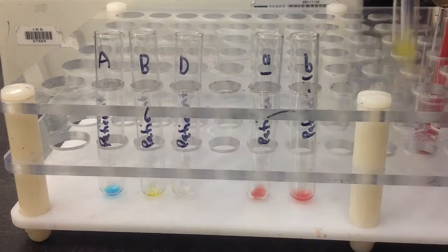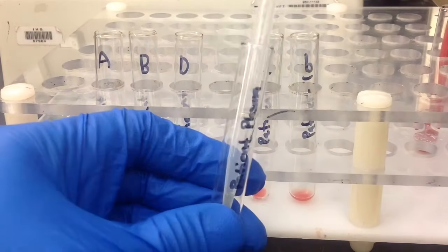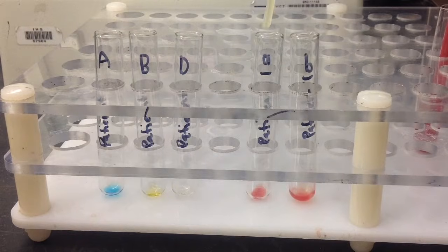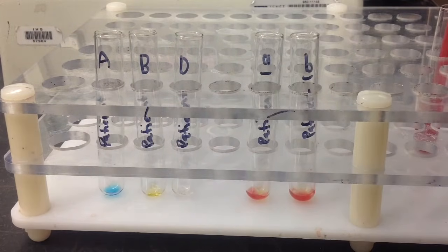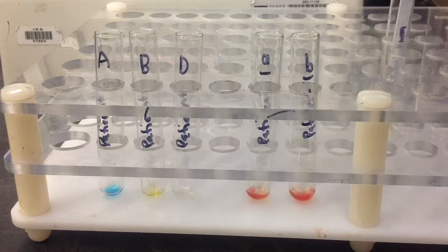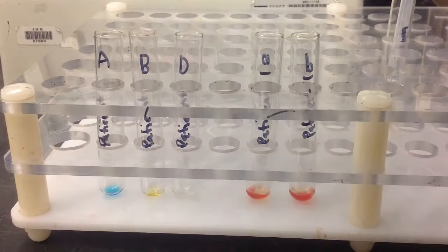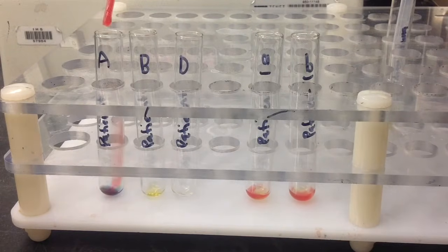And then from here, I go ahead and start with the plasma. And for plasma, you're going to add 2 drops of patient plasma to each one of the reverse tubes or the reagent red cells. And then with the patient red blood cells, it's just 1 drop in each of the anti-sera tubes.